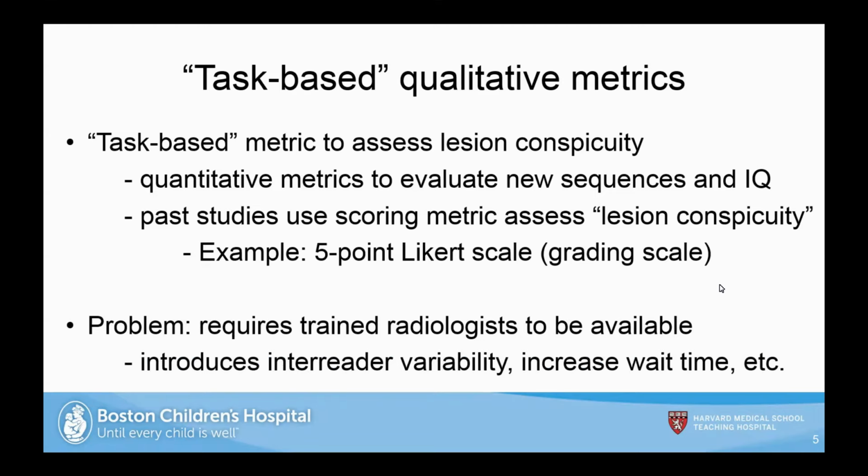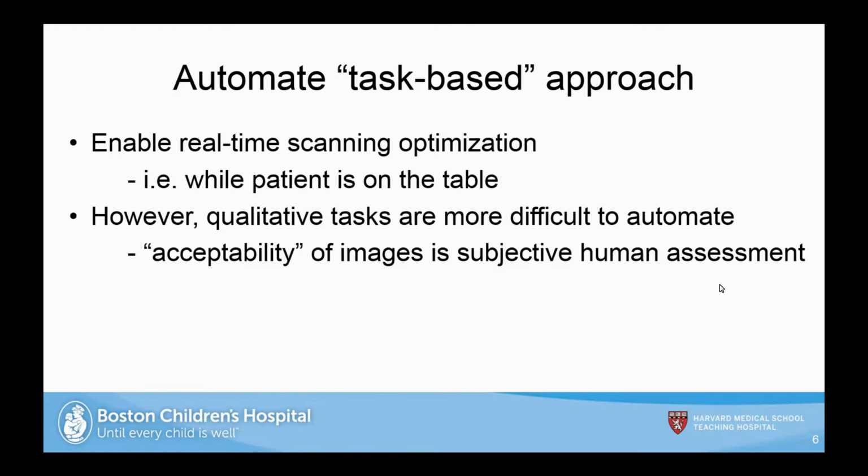But the problem is this requires a trained radiologist to be available, and this can introduce inter-reader variability and also increase wait time, etc. So they wanted to automate this task-based approach, and that would enable real-time scanning optimization, so while the patient is on the table. However, these qualitative tasks are more difficult to automate, and the acceptability of these images is subject to human assessment.